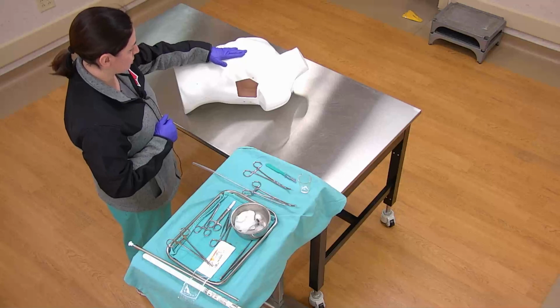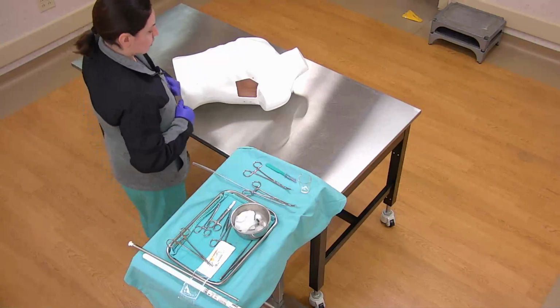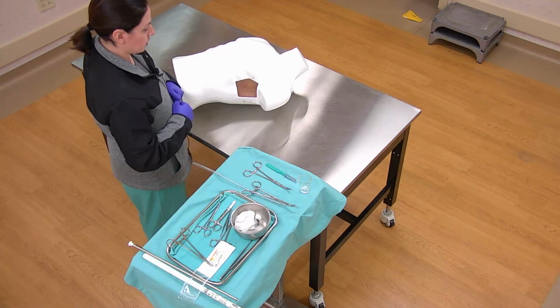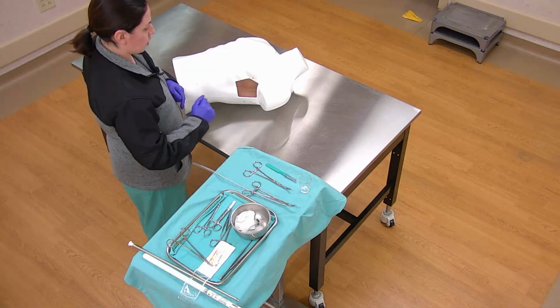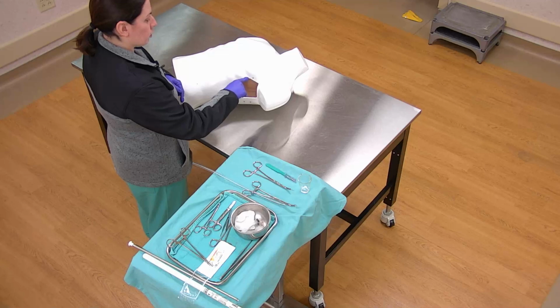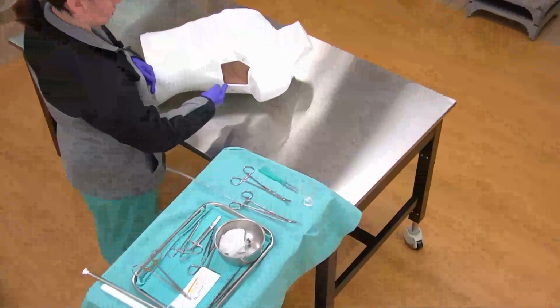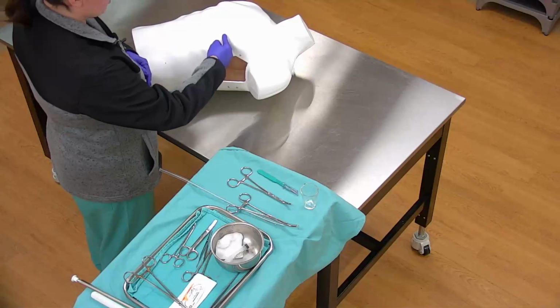This is our patient. Placement is really important, and I like to think of the triangle of safety. Its three borders are the lateral border of the pectoralis muscle, the anterior border of the latissimus dorsi, and the inframammary crease.